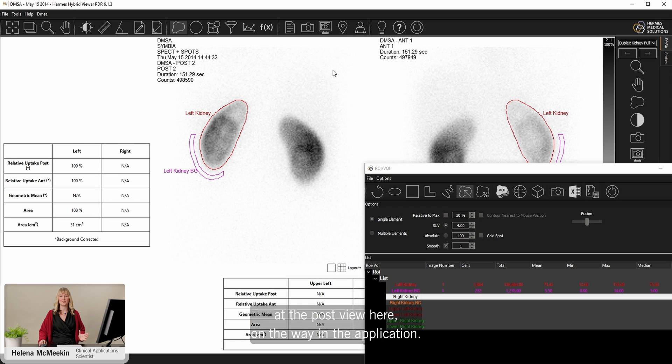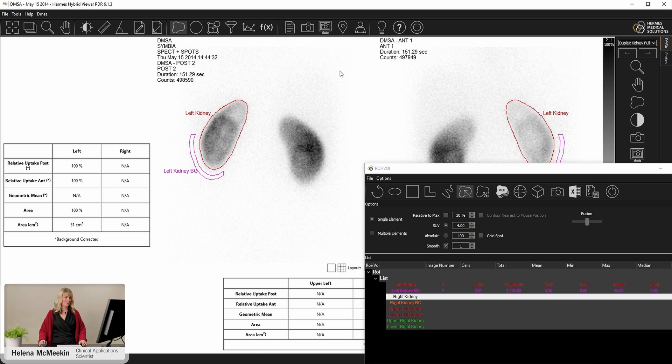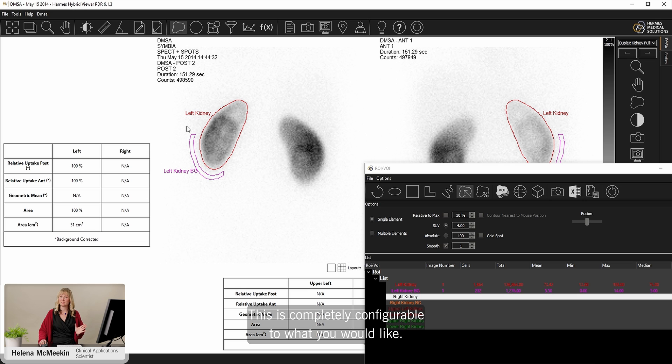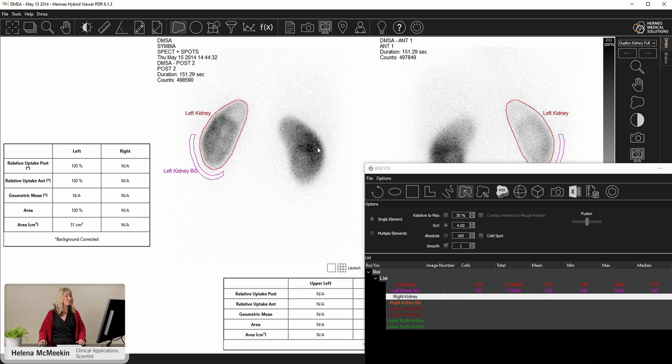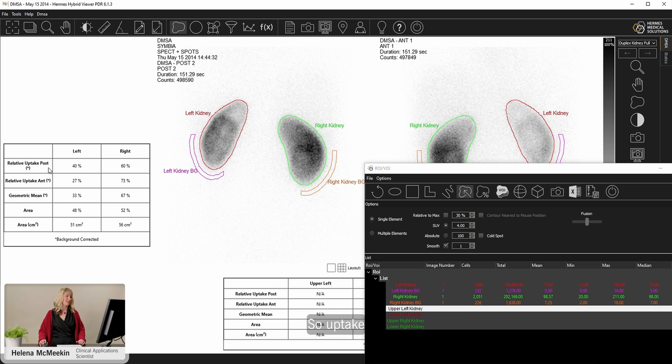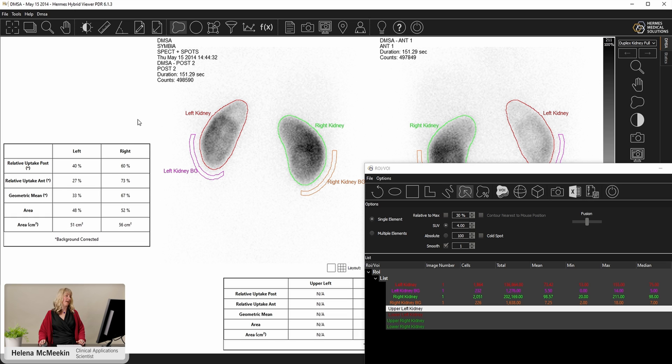So I'm looking at the post view here. On the way in, the application worked out which was the posterior and which was the anterior image. So it automatically placed the background region. This is completely configurable to what you would like. We've automatically moved straight onto the right kidney. Do the same on the right hand side. And straight off we have the results here from the processing.